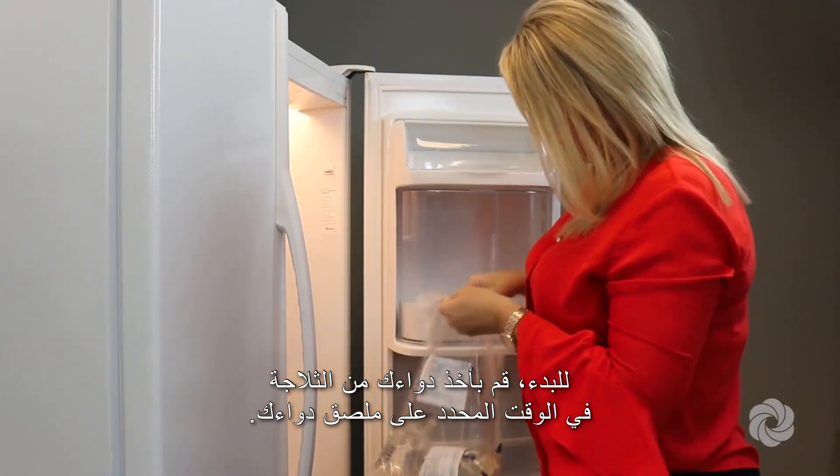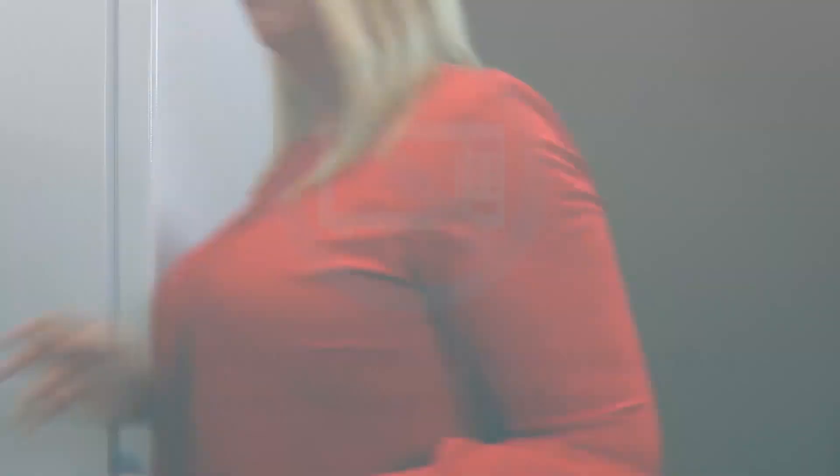To get started, remove your medication from the refrigerator at the time specified on your medication label. Never speed the warming process by heating or microwaving the medication.